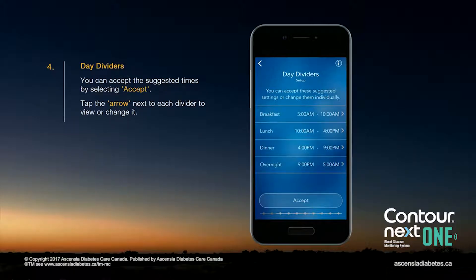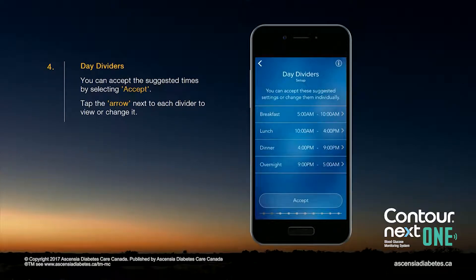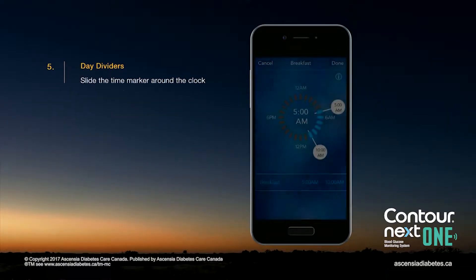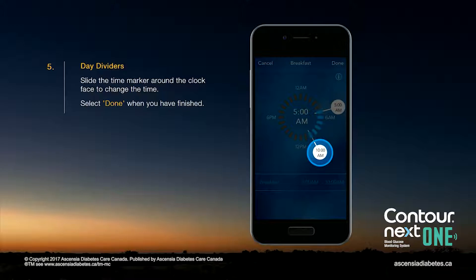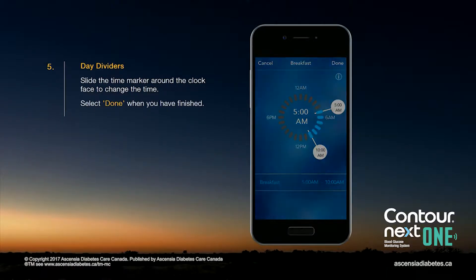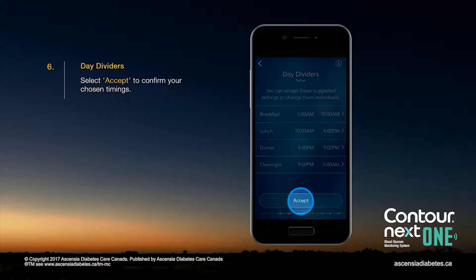You can accept the suggested times by selecting Accept, or tap the arrow next to each divider to view or change it. Slide the time marker around the clock face to change the time. Select Done when you have finished, then select Accept to confirm your chosen timings.